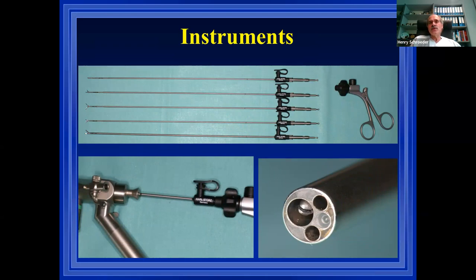And when we do our courses, you see frequently that the instrument comes and hits the contralateral wall, because you're not aware how deep you are. But with this marking, all the instruments have it, you know exactly where you are.